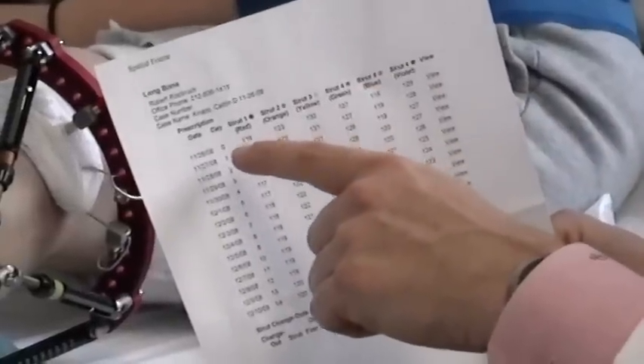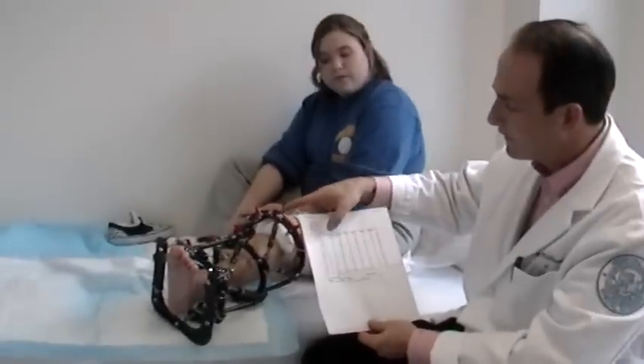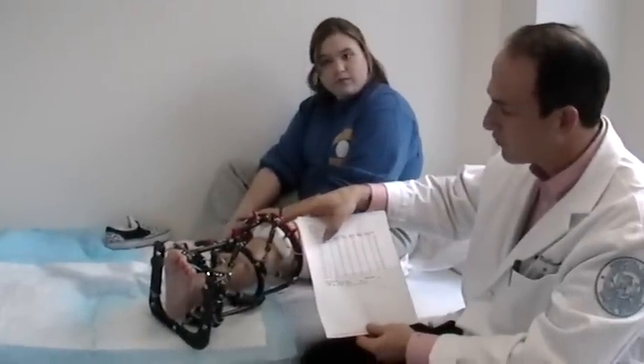The idea is to make adjustments of the struts so that you complete a full row each day. The first day is day zero, which is where the strut happens to be at this particular point in time. Then day one, which would be tomorrow, you're going to make this whole row of adjustments.